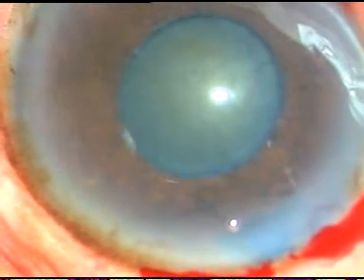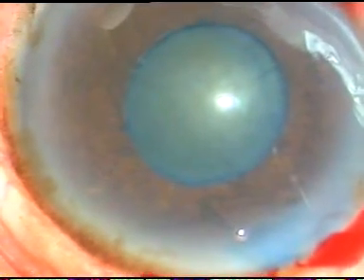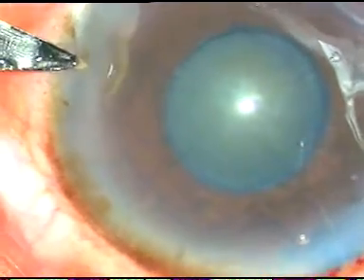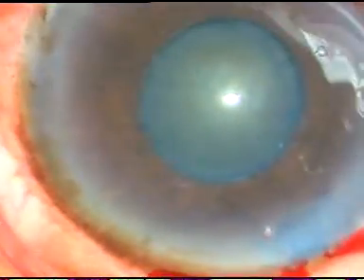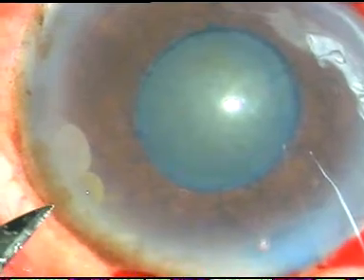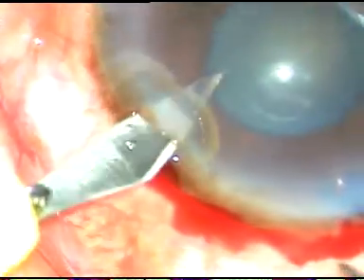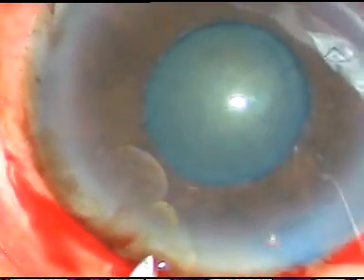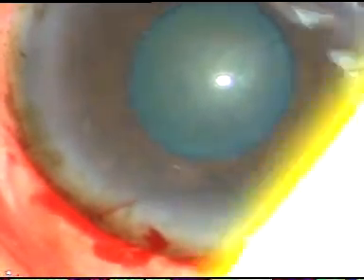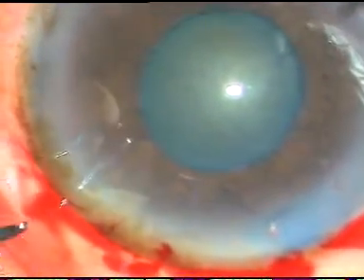Now I am making some stab incisions. One stab incision has been given at 10 o'clock. This is at 4 o'clock and this is a side port incision for introduction of the chopper. This is a stab incision at 1 o'clock and one more stab incision at 7 o'clock.